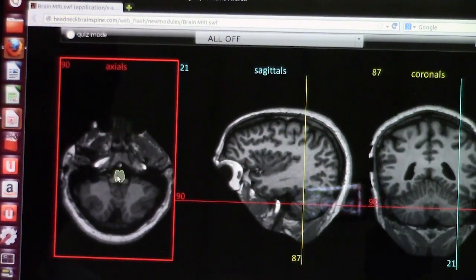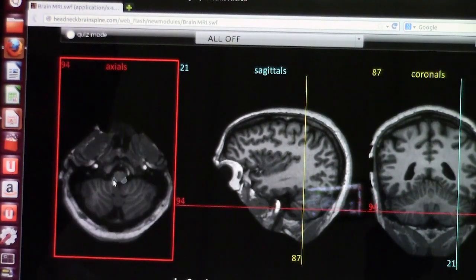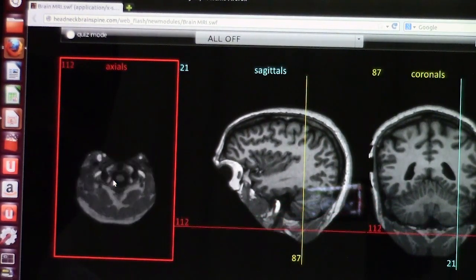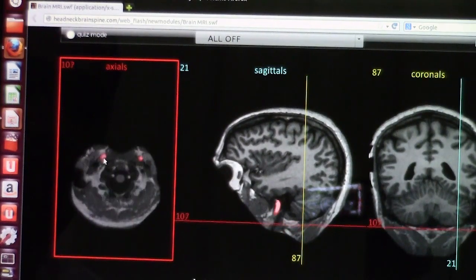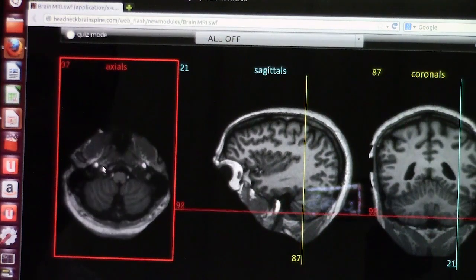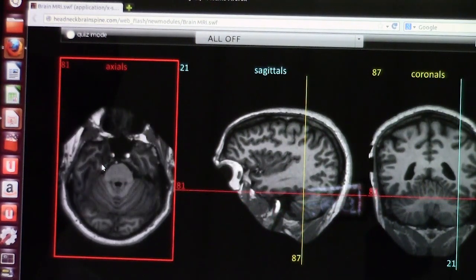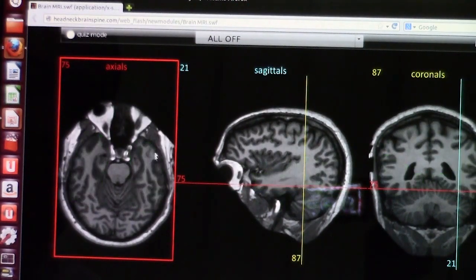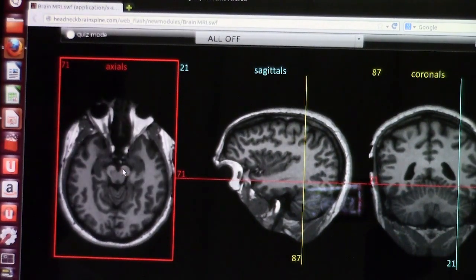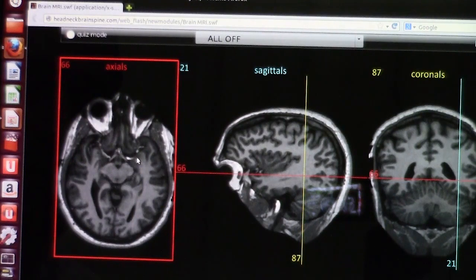As you go more down, you come to the medulla oblongata. This cut is made with contrast — you can see the internal carotid artery. The vessels are taking up contrast. Going up, you see the internal carotid artery in its cavernous segment, which gives the ophthalmic artery, then continues to the supraclinoid segment and becomes the middle cerebral artery. Here you can see the optic chiasm and the mammillary body nicely.